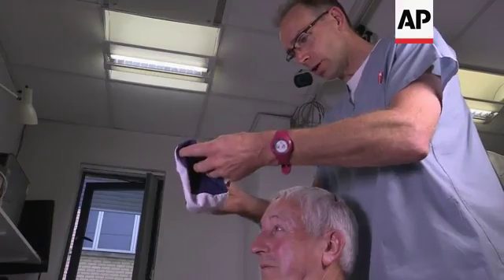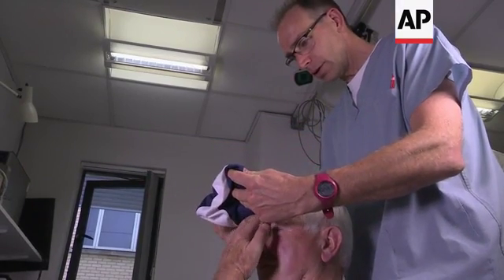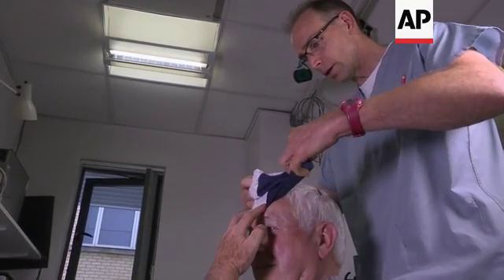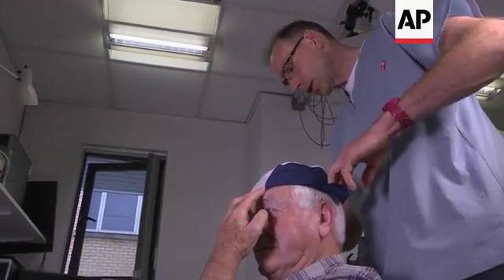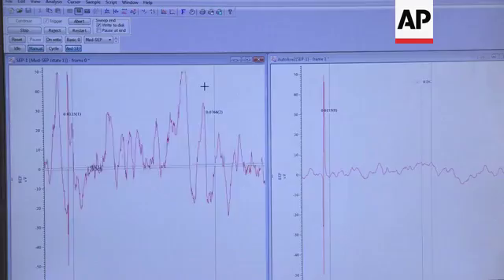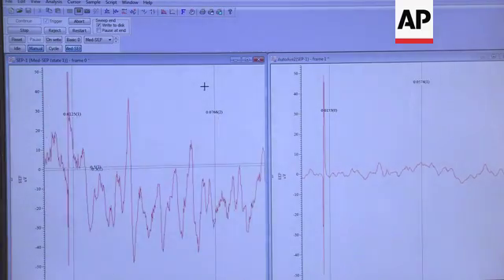So this is just taking the remnants of that gel off. You can hold the front of the cap. Tell me when you've got that. Okay, here we go. Keep hold of it. Okay, that's a nice close image of the screen.